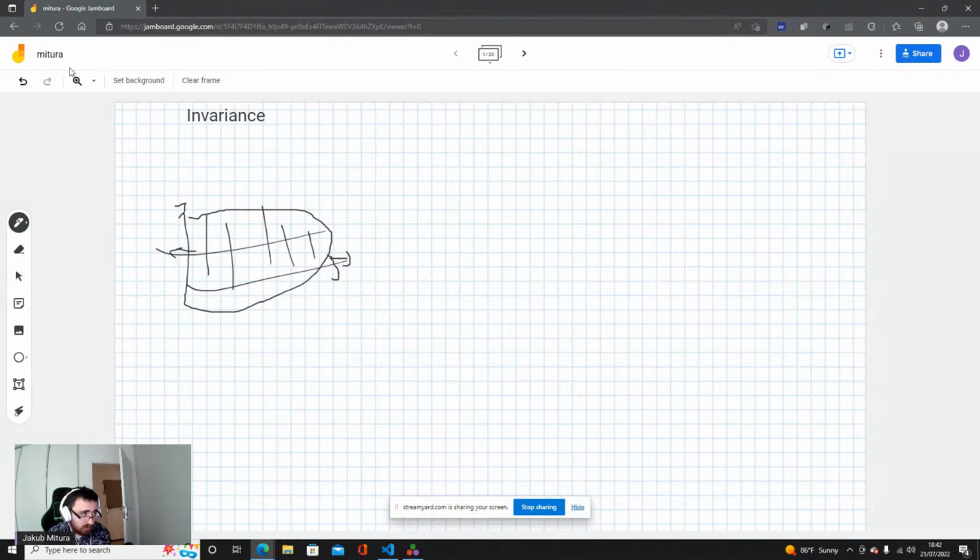For example, in the case of the liver, we know that we are breathing, so translation up and down is common. It's normal. When we augment the data by translation up and down, we train the neural network for cases that are normal. The liver does not rotate 90 degrees, so that is not normal. If you added an augmentation that rotates the liver 90 degrees, the neural network would learn something that is fiction. So it's not useful, basically.